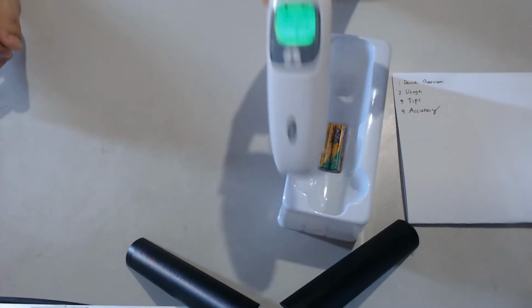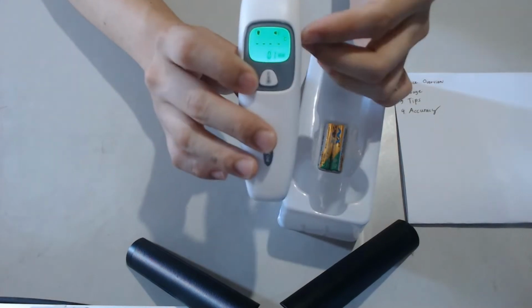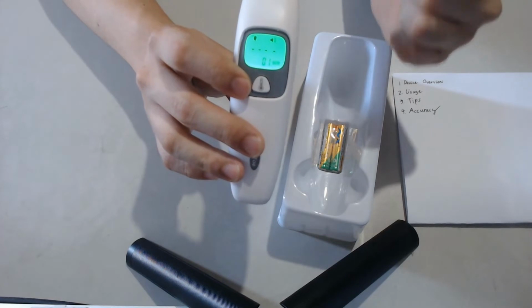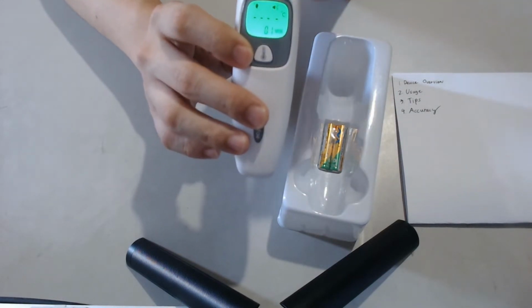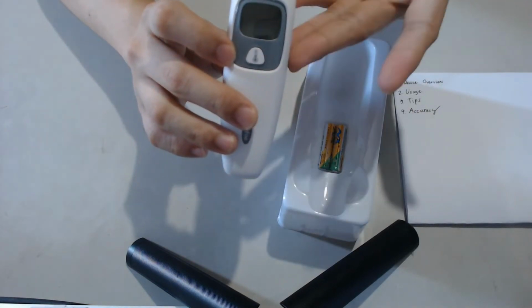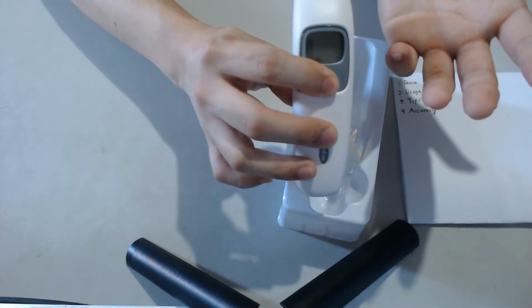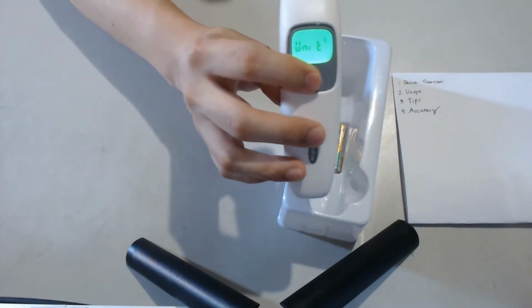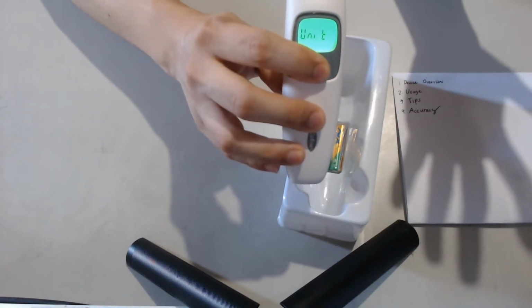Now, does this have settings? Yes. One of the obvious settings is to change from centigrade to Fahrenheit. To do that, you have to start in the off state, so I have to wait until this turns off. Then hold the single button for 3 seconds. F1. Now I can change whether it's in Celsius or Fahrenheit. One button operation. To go to the next setting, I hold this for 3 seconds.